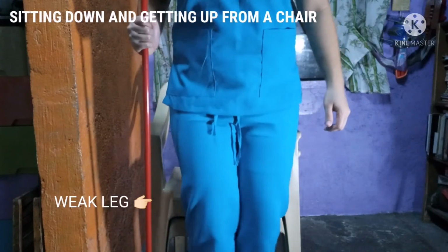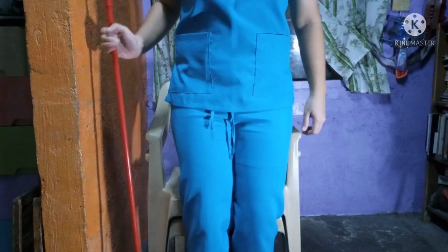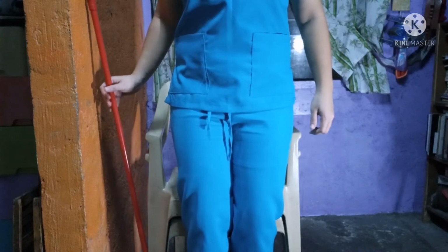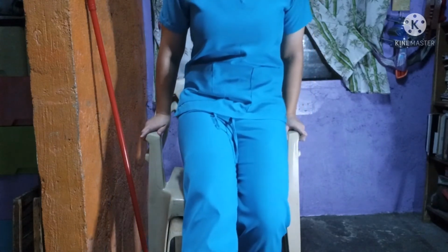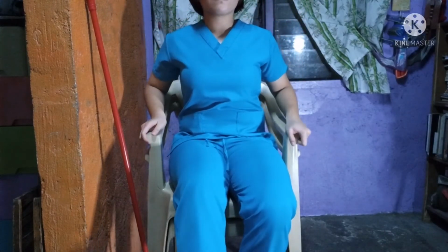Sitting down, the patient will back up to the chair until they feel the chair with the back of their legs. The patient will then allow the cane to rest on the side of the chair. Then the patient will place both hands on the chair's armrest, place weight on the hands, and bend the strong leg while keeping the weak leg slightly extended and sit down in the chair.